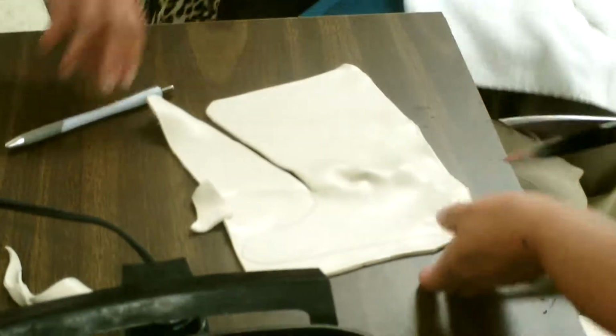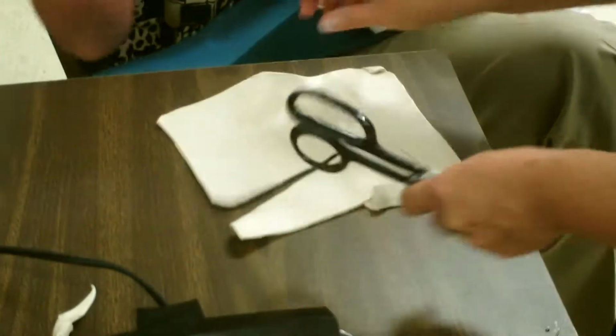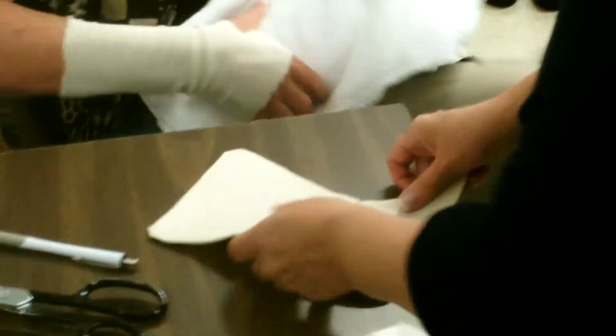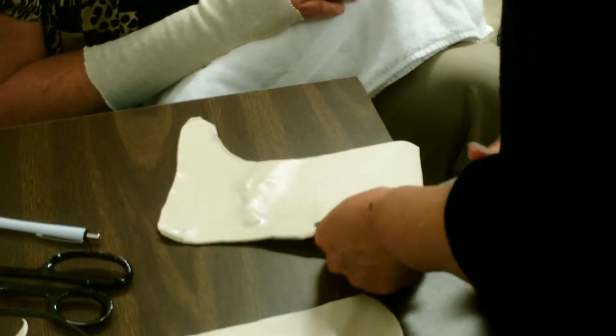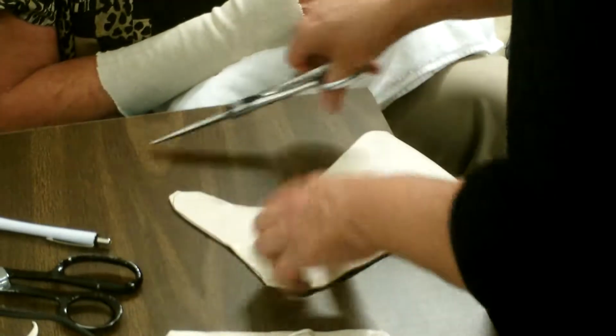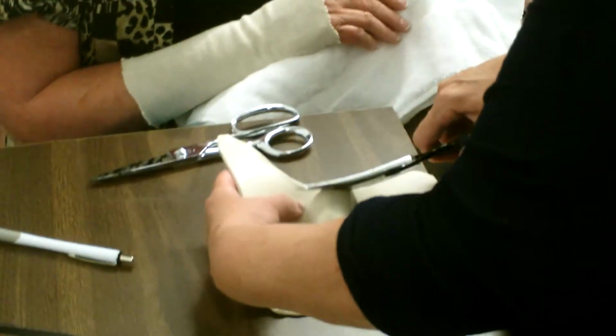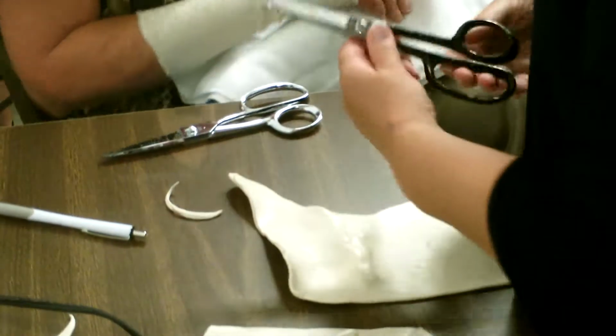So now remember I said you've got curves to deal with? Y'all can come up around here, guys. So where were those curvy scissors? Now here's the little curve. See right here, this helps get in the curve nicely. So now look, I screwed up here. I'm so upset with my work. I'm going to trim this down because I could just tell that this is going to be too big. And I don't want Miss Rita uncomfortable about my pen marks. So I'm going to cut inside my pen marks so Rita doesn't see them, because she's not going to wear it if she sees pen marks.